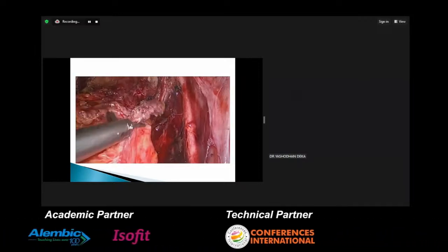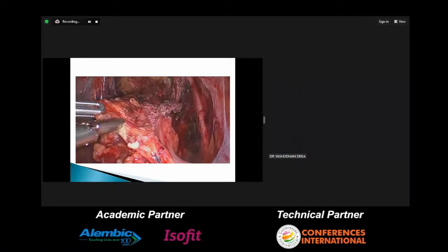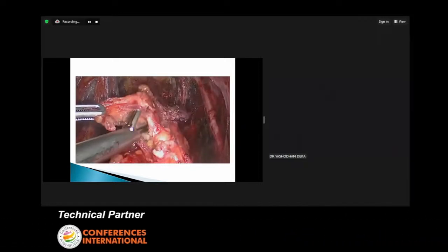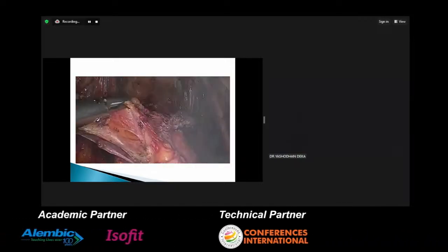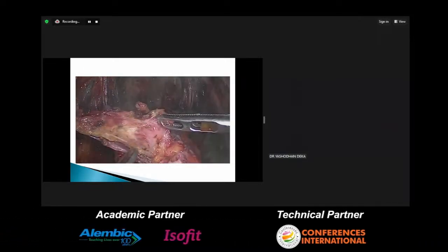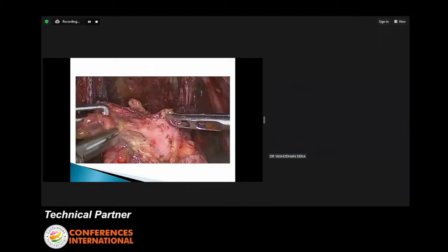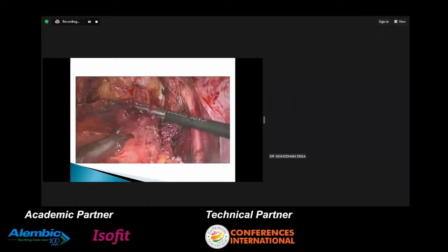You can palpate it, see how I'm not able to close my instrument, and then you have to do good bowel shaving. Nowadays you have a new ultrasonic probe that has come into the market, a 10 mm probe, and you can introduce it into the patient's abdomen and trace the lesion. It is a very good technology, especially if you do a lot of shaving. In our center, we don't believe in a lot of shaving, because I feel shaving is not a standardized technique, and with shaving you can never know how much you've left behind. And after deep shaving particularly, I'm very insecure about leaving the bowel open with so little muscularis and serosa on top. So we feel that if it's a small lesion, it is better to go for discoid than shaving.